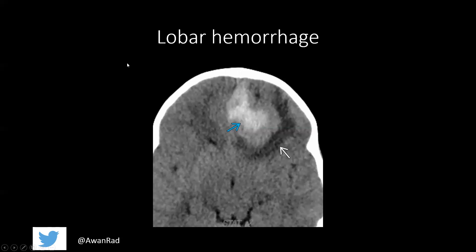Lobar hemorrhage is when you get hyperdensity confined in a lobulated contour within a lobe of the brain. This is the left frontal lobe. The hypodense or darker area surrounding it is edema around this lobar hemorrhage — it's within the parenchyma of the brain itself.